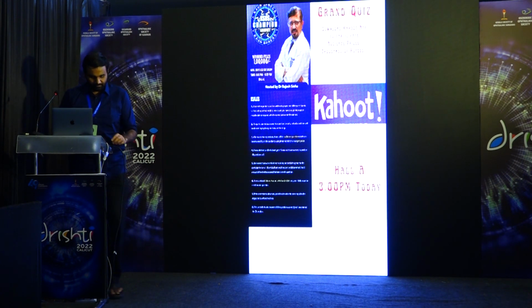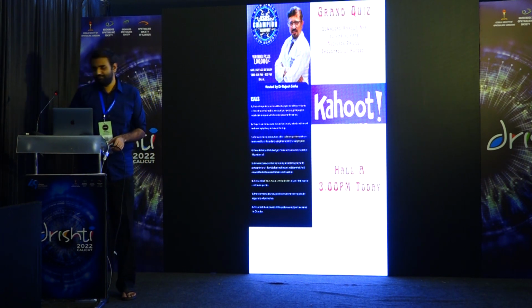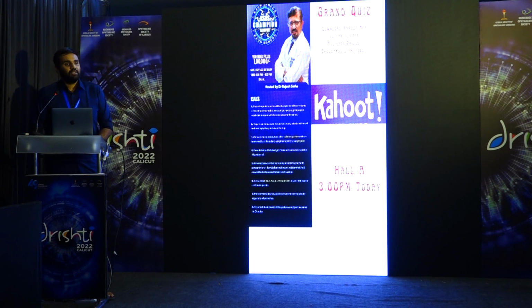Thank you, Dr. Sanjeev, for that excellent talk. Just one question, Dr. Sanjay. Can we use the Nd:YAG laser to do the anterior stromal puncture? If so, what are the parameters?